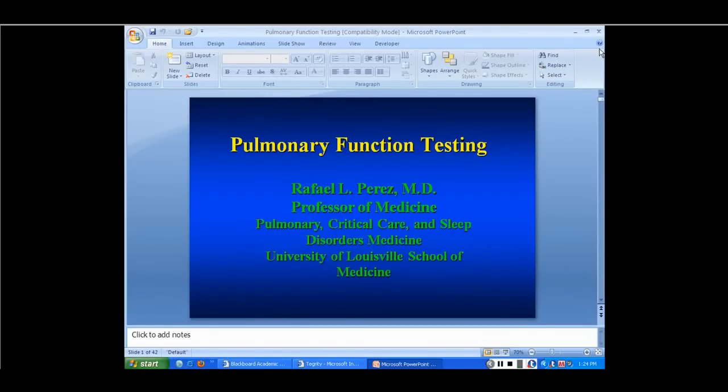So in selected situations in adult medicine, those mid flows are important. Sometimes, if the patient's really symptomatic, the ratio's normal, the FEV1 and FVC really don't strike you as much, the FEF 25-75 is significantly down, you can say there's a suggestion of small airways. So sometimes when you're in that gray zone, I use that to say there may be some very distal airways disease or something like that. Yeah, but that's a great question. Thanks.